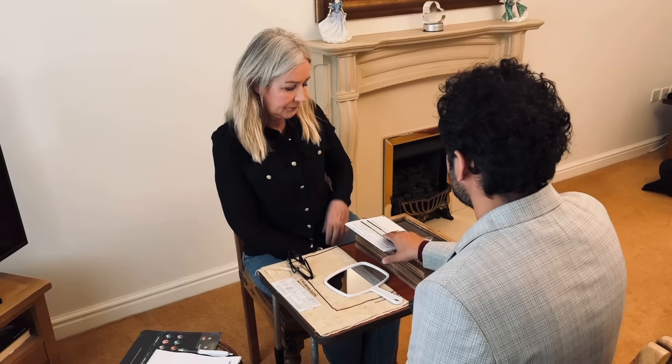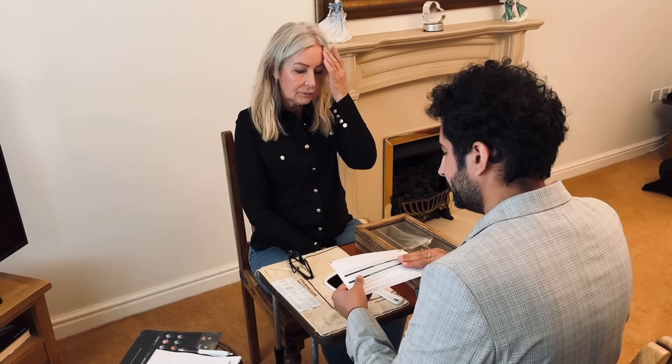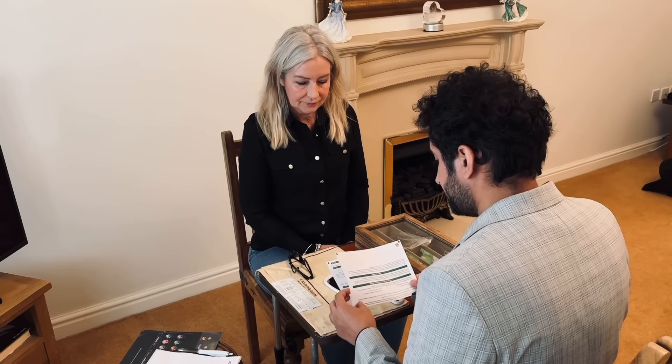Hello there. Hello. You alright? Yes, thank you. Okay, so this is your prescription. Just have a little look from your eye test today.